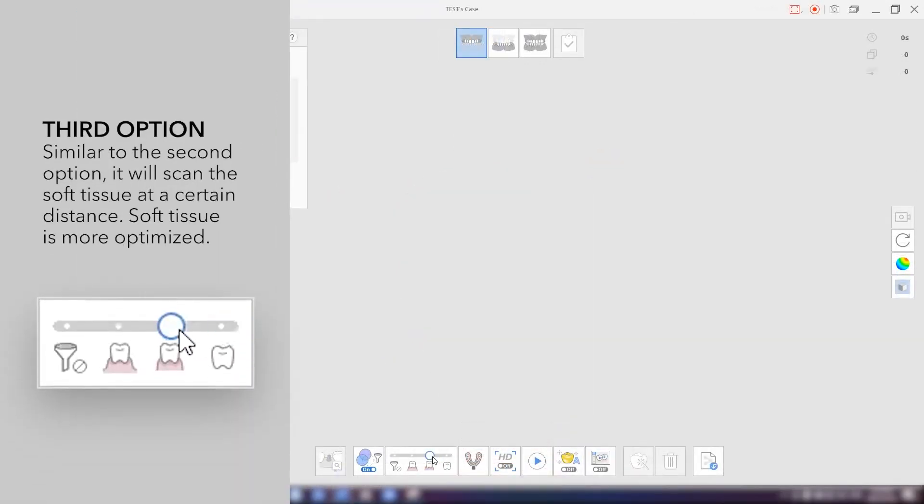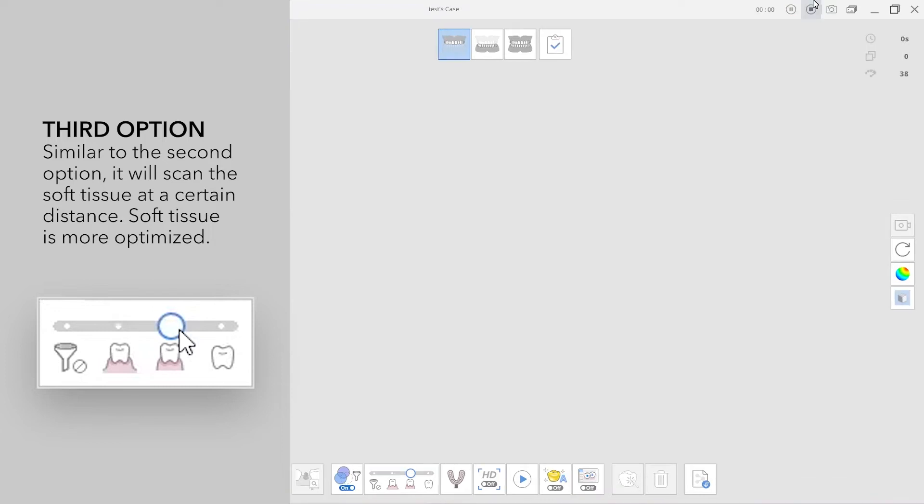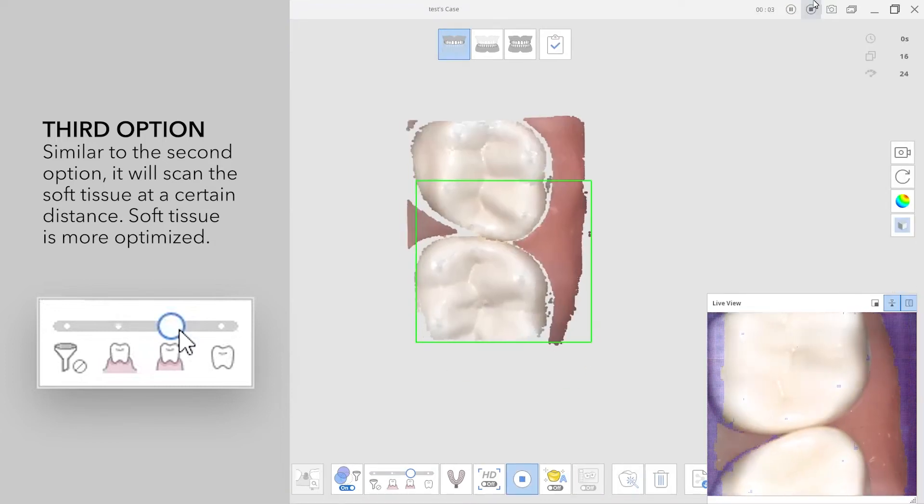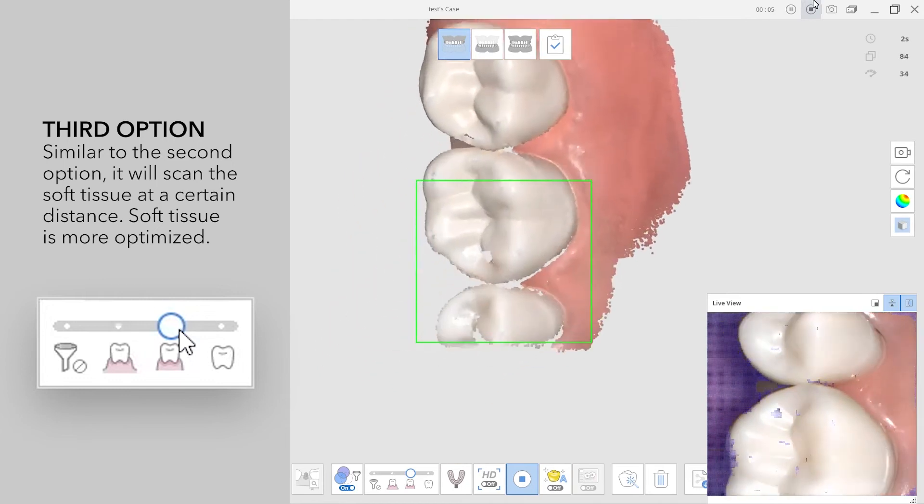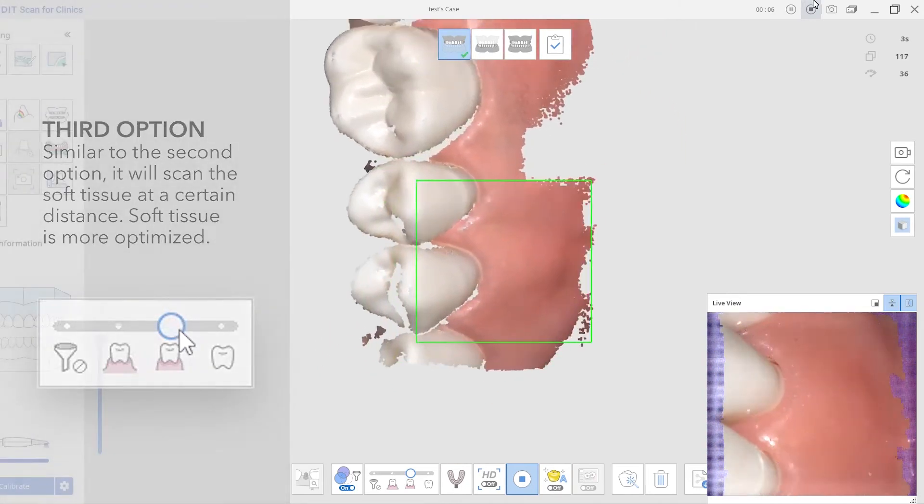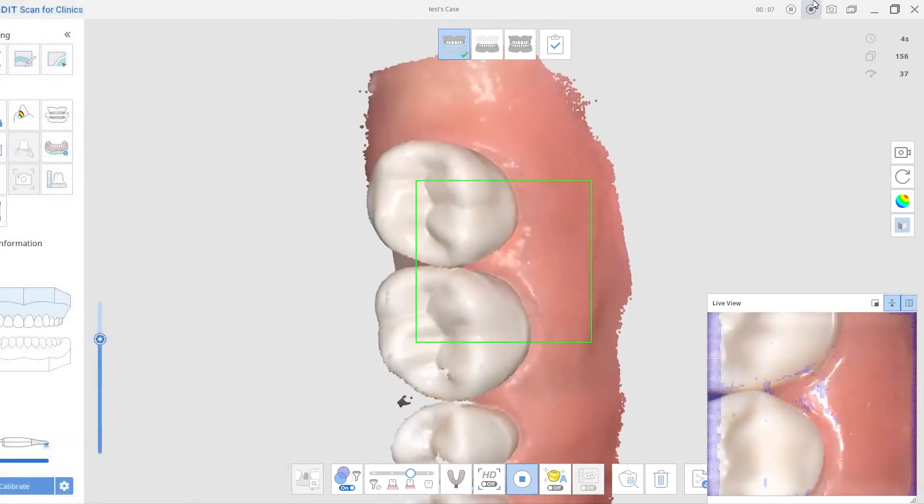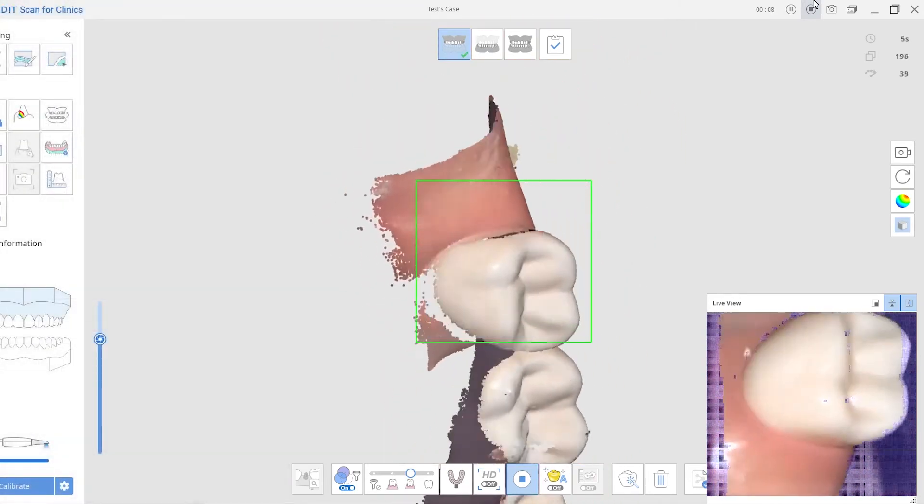The third one is similar to the second one, but this is scanning within a certain distance from the teeth so you don't get much soft tissues. Soft tissues will be optimized a bit more.